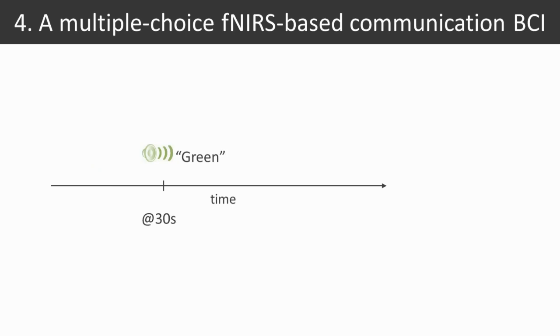Then after 10 seconds the next stimulus appears, namely green, and when the subject wants to encode red and has started before with the encoding, now has to stop and just await the rest of the encoding trial. But you see, after 10 seconds each, another option is highlighted, and after the fourth option is highlighted, like here, after 10 seconds, then there is a command like stop, so that the subject, when encoding the last answer option, also knows when to stop the performance of the mental task.